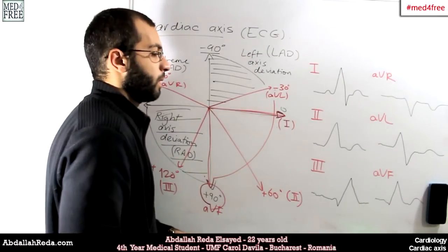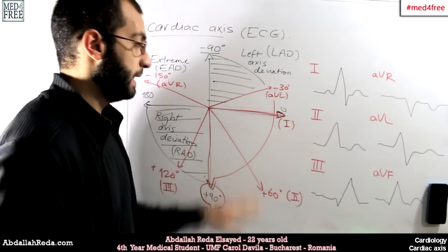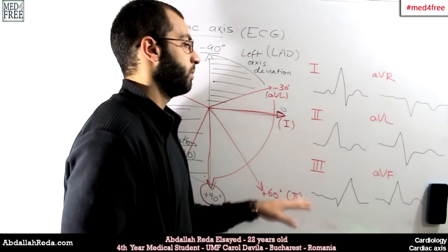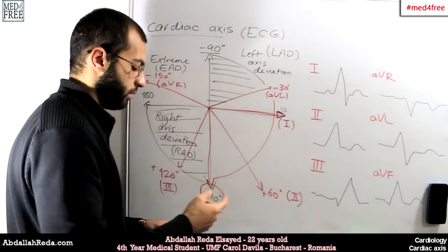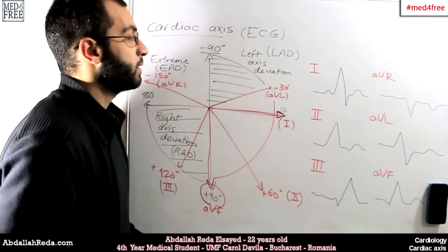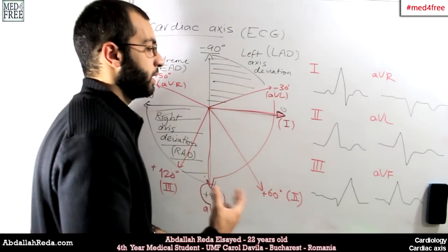Now, we did not talk about the components of the ECG, the QRS complex, the P wave, the T wave, and so on and so forth. This we're going to talk about next time. But the method of today is quite easy, and we'll understand how it goes.